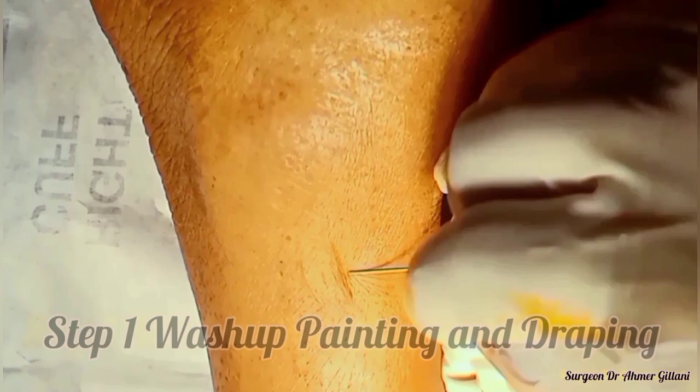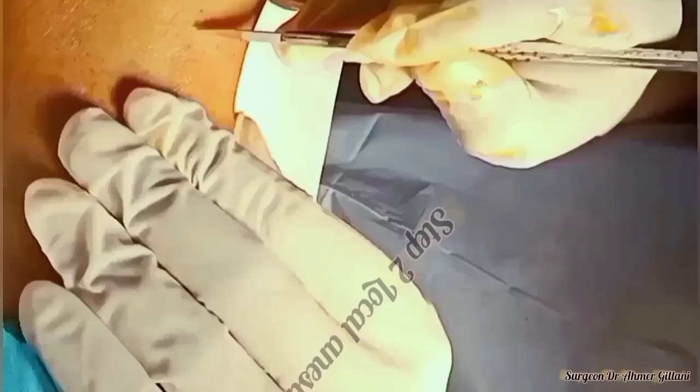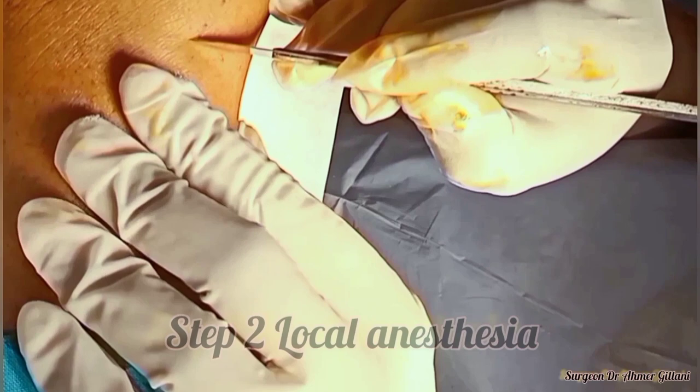Here we are going to learn the procedure of the venous cut down. Basically, when we are not finding venous access, for that purpose we will do the procedure of the venous cut down.